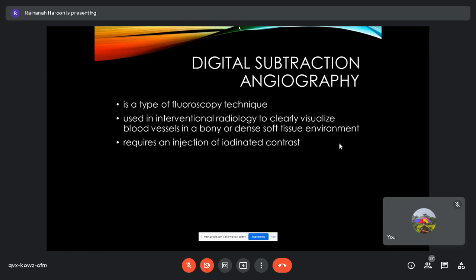So DSA. Just so you know, our machine down here is so sophisticated. Not all hospitals have this, because we have Prof. Razali as an interventional radiologist who is capable of doing a lot of angiographic procedures, especially the therapeutic ones. An ordinary radiologist like me can only do simple things, the diagnostic ones.